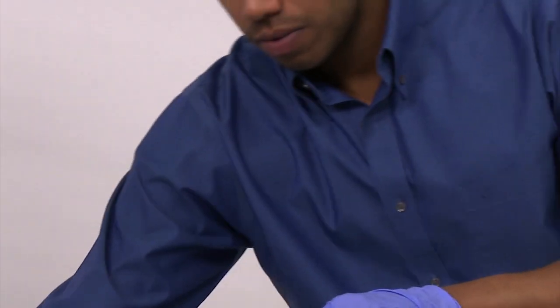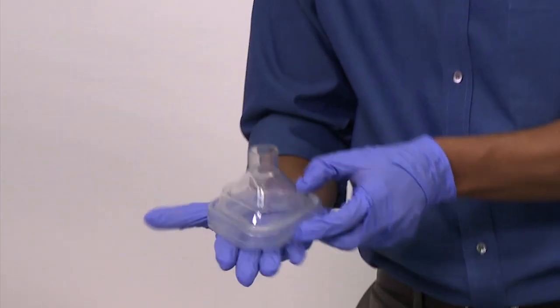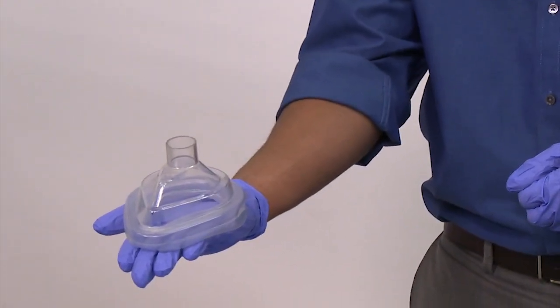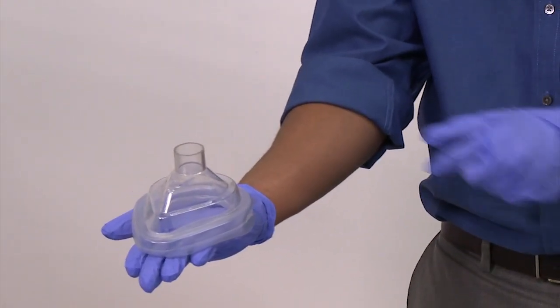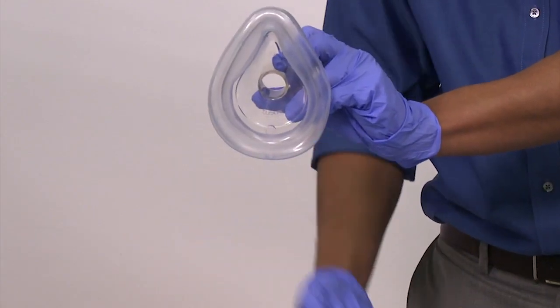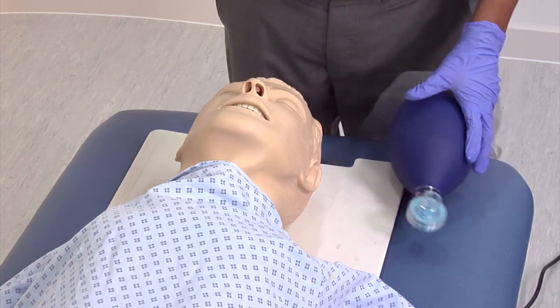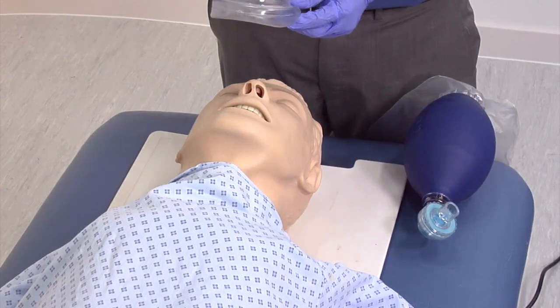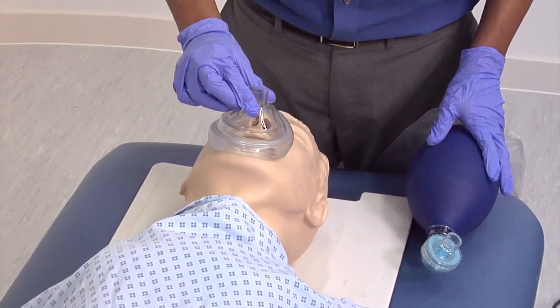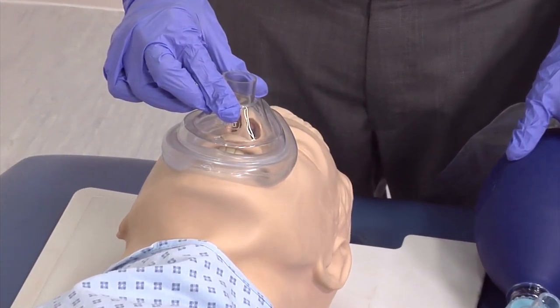The mask delivers air to the airway by forming a tight seal around the patient's nose and mouth. Correct sizing is critical to ensure this seal and should be done by placing the mask over the patient's nose and mouth so that they are covered. The mask is too big if it extends over the chin.